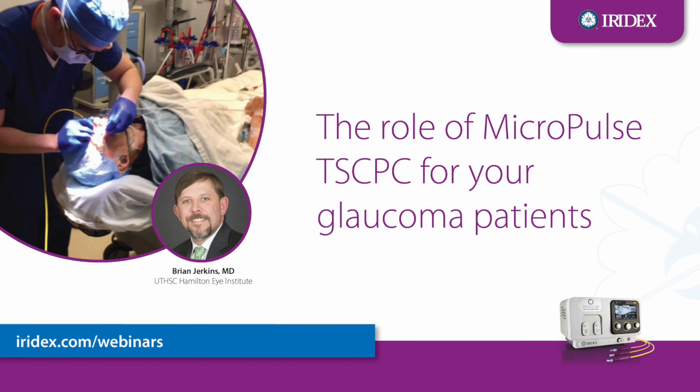I think the tough part here for surgeons is, these eyes have been, for lack of a better term, marinating in a number of pharmaceutical agents to lower the IOP for so long with all these vehicles and preservatives. It's hard not to get a patient in glaucoma that doesn't have some dry eye, exposure or some ocular surface disease. And then on top of it, you've got a technology that's delivering energy that if you aim it towards the limbus, you are treating stem cells and goblet cells and ciliary arteries. So it's difficult to maintain that proper technique to ensure that you don't enhance those dry eye symptoms.